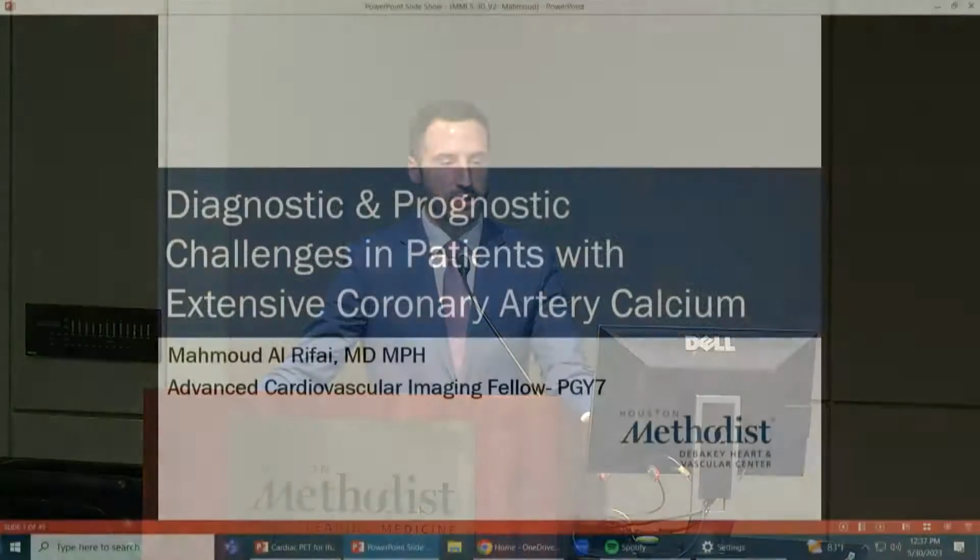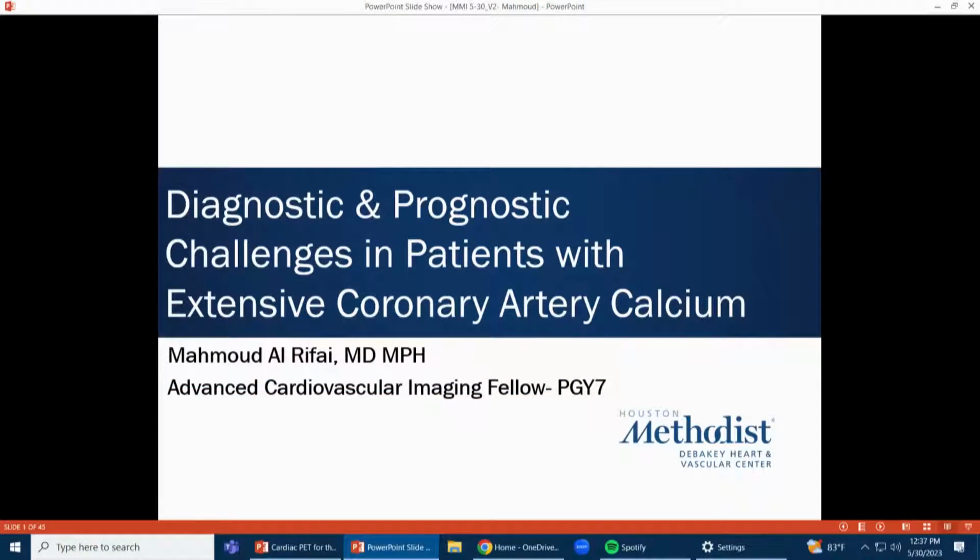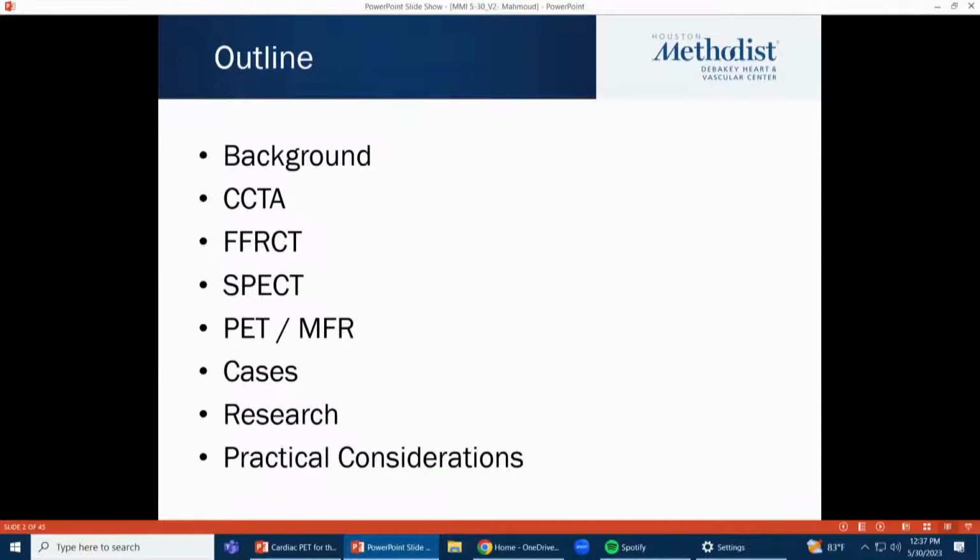The title of my talk is Diagnostic and Prognostic Challenges in Extensive Coronary Artery Calcium. I think this is something that we commonly encounter, and it can be a little bit of a challenge when interpreting these studies. So I wanted to bring this to the forefront and see what opportunities we have to improve diagnosing these patients and prognosticating. This is the outline of my talk.